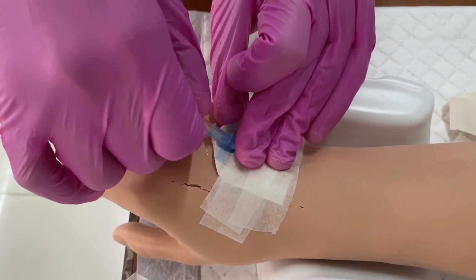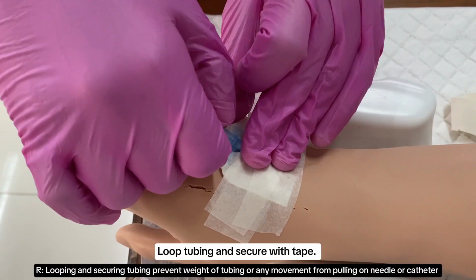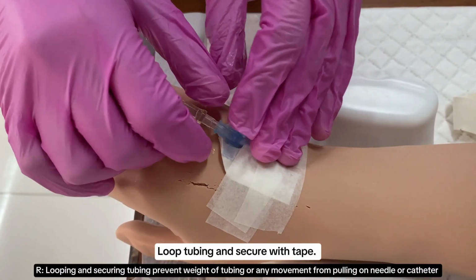Loop the tubing and secure it with tape. Looping and securing the tubing prevents its weight or any movement from pulling the needle or catheter.